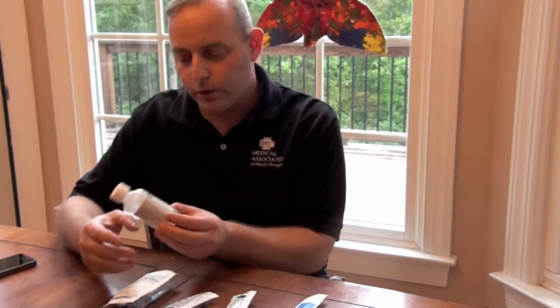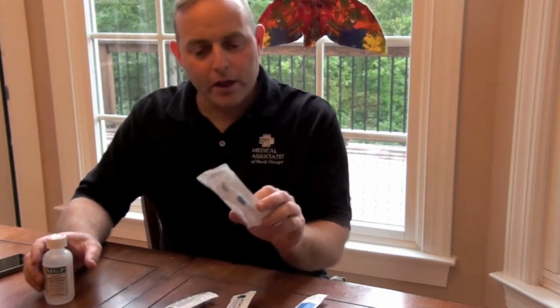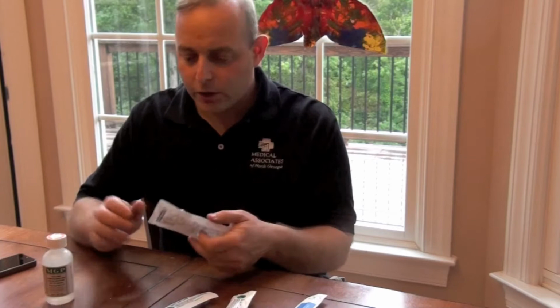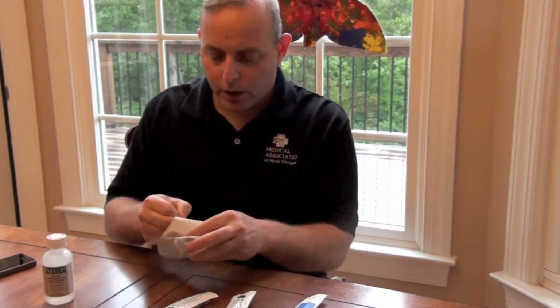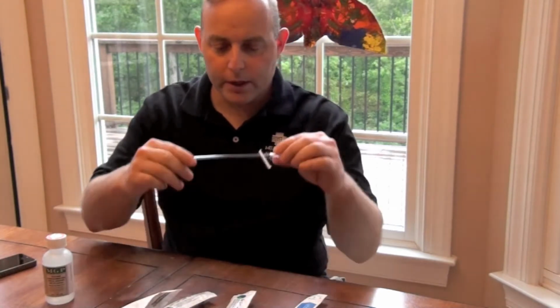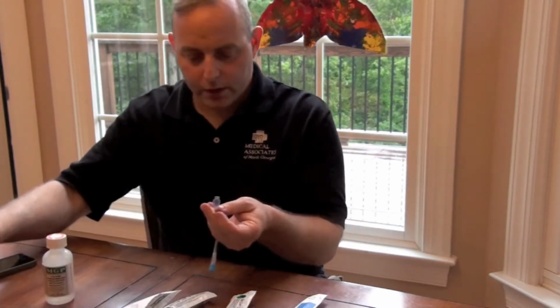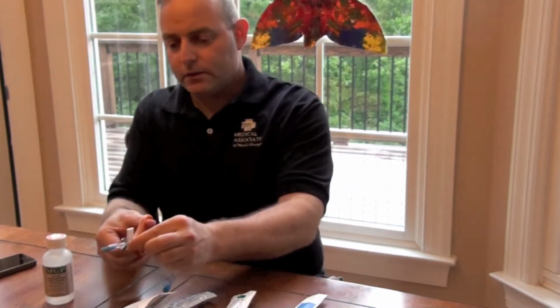The supplies include a viscous lidocaine topical 2% solution. I have a Braun extension set. It is a 1 ml priming volume IV extension set with luer lock, male and female at both ends. And we actually prepare that by cutting off the female side of the luer lock right at the base.